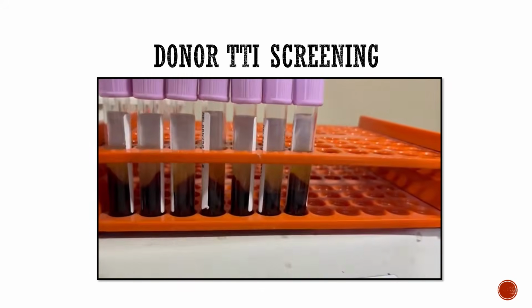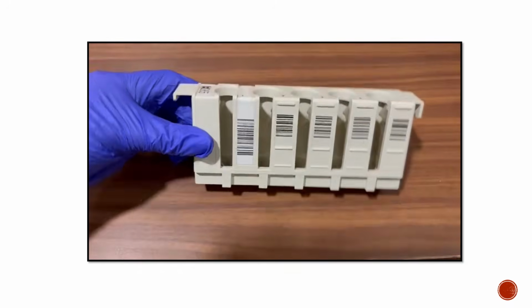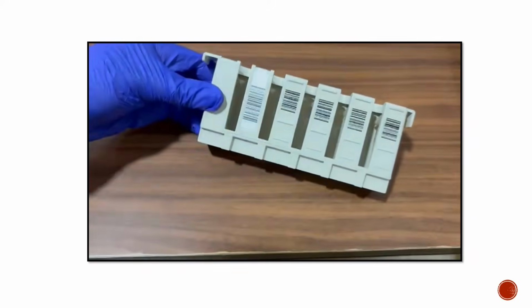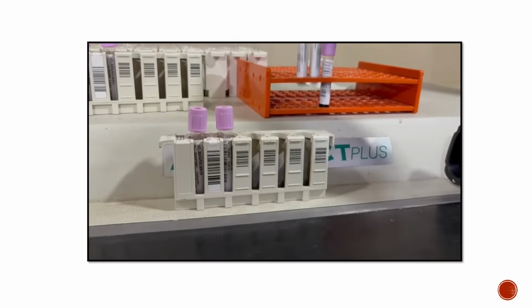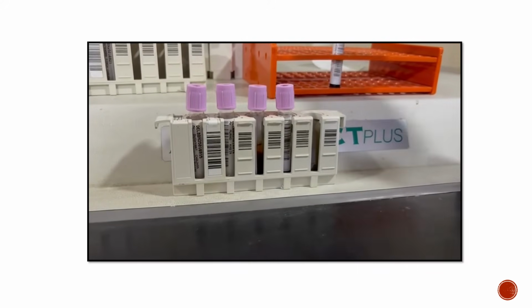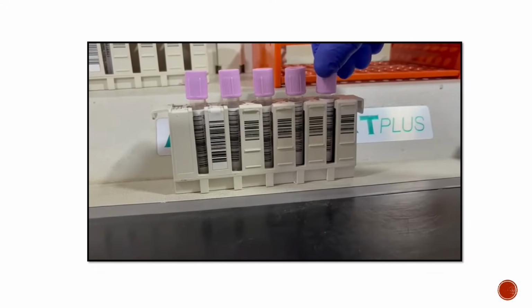These are the same samples after centrifugation. This is the barcode labeled sample carrier. Now the centrifuged samples should be loaded into this carrier, and pushed completely into the carrier, and the barcode of the tube should be facing out.